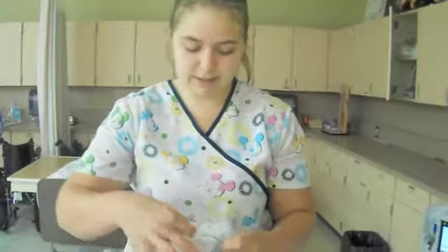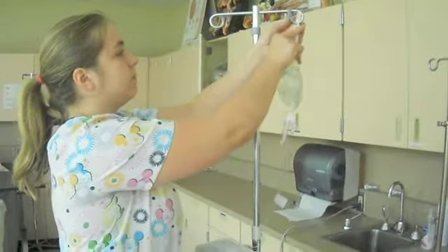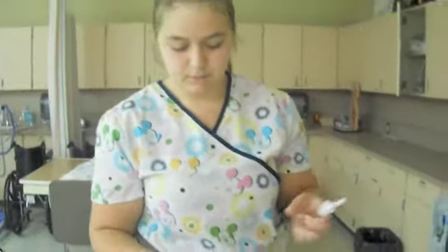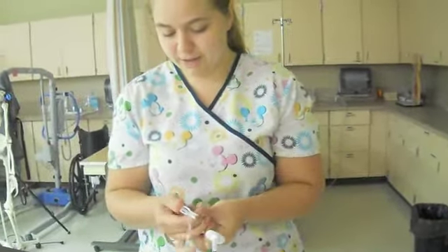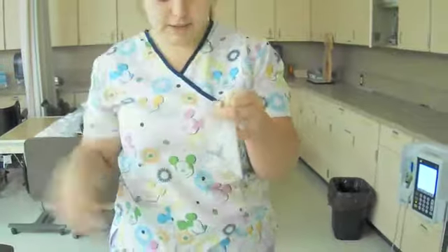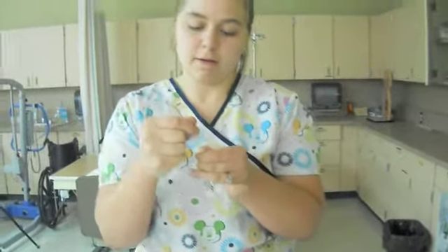So I'm going to set up my IV piggyback set. I'm going to do this piggyback just so it can continue to run. I'm going to take this clip — you need the main bag at a lower level. I'm just going to attach it, turning it to a lower level. Make sure it's all untangled, and we're going to clamp the roller ball, make sure the tubing is clamped. And again, this is sterile to sterile. I'm just going to spike the bag in that inner seal.